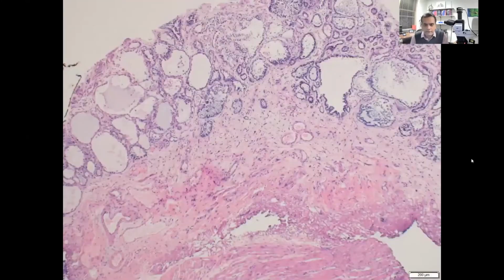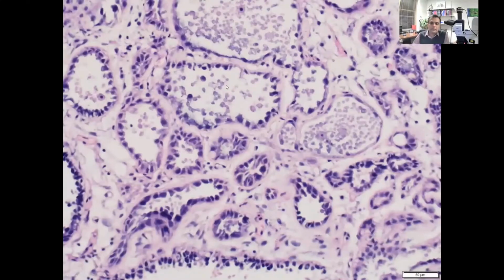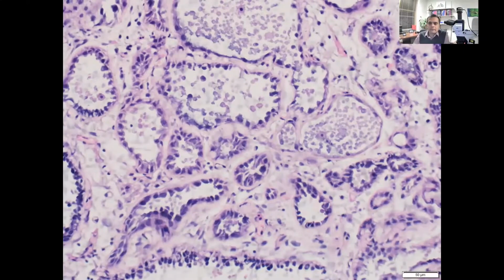So in this transurethral resection specimen, this large fragment, we see a polypoid structure, which has a lot of these unusual cystic elements. This is a very unusual presentation for a bladder tumor. And if we look closely, we see many of these cystic elements are lined by these sort of hyperchromatic cells, which seem to have some hobnailed nuclear appearance here, and they seem to have some secretions.